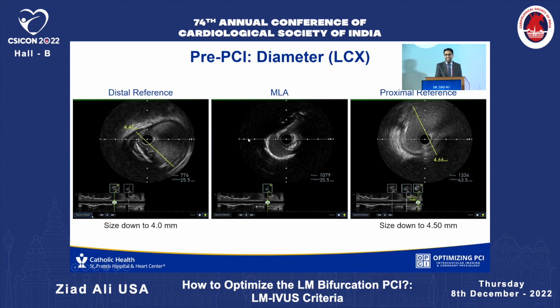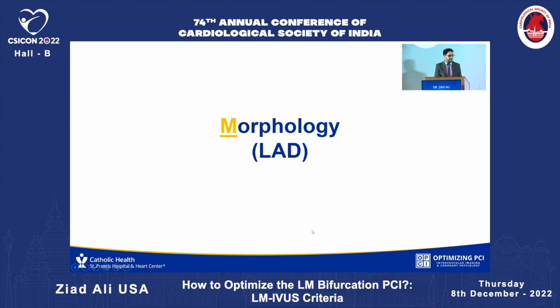Diameter measurements are EEL rounded down, if at all possible. If we have a 50% plaque burden or greater, we use the lumen and size up. That minimizes our risk of dissection.